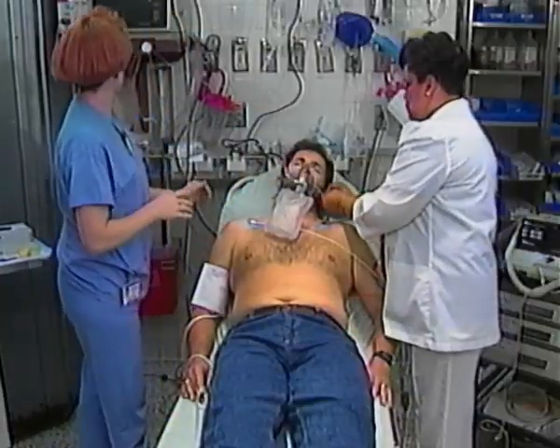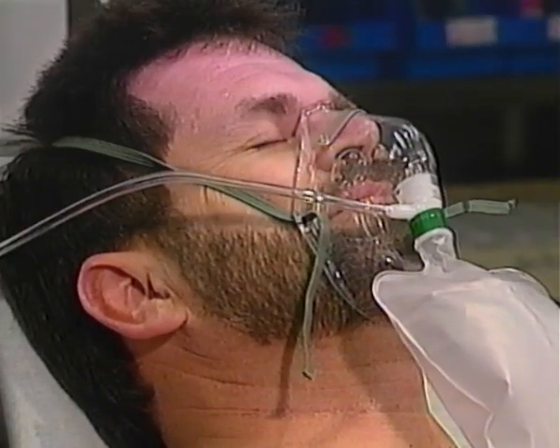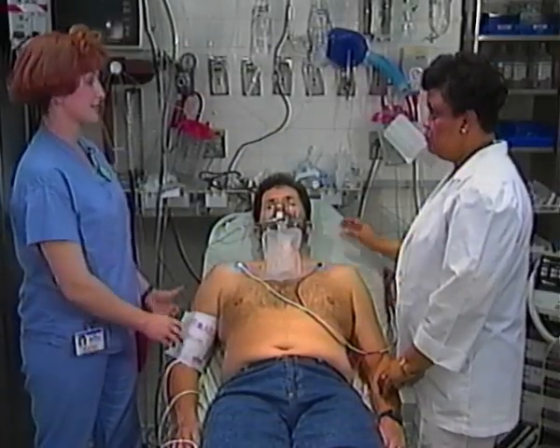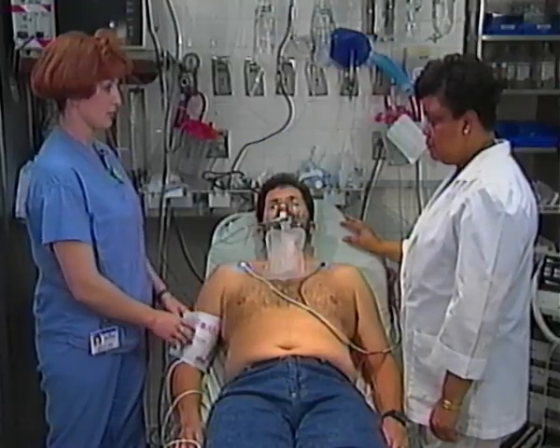He has a V-tach rhythm. His pressure's 74/50 and his heart rate's 190. His respirations are running around 24. He has bibasilar rales, and his skin is cool and clammy. I'm going to go ahead and establish IV lactated Ringer's and get labs and lytes per protocol.